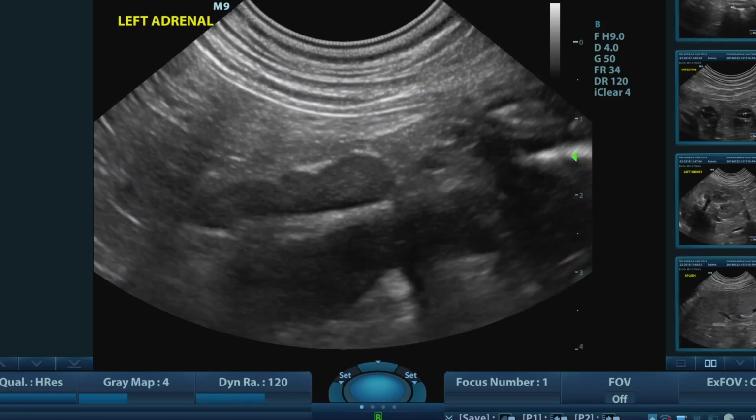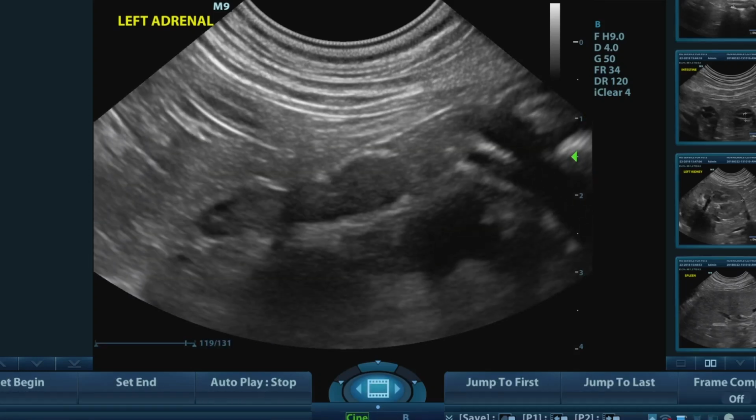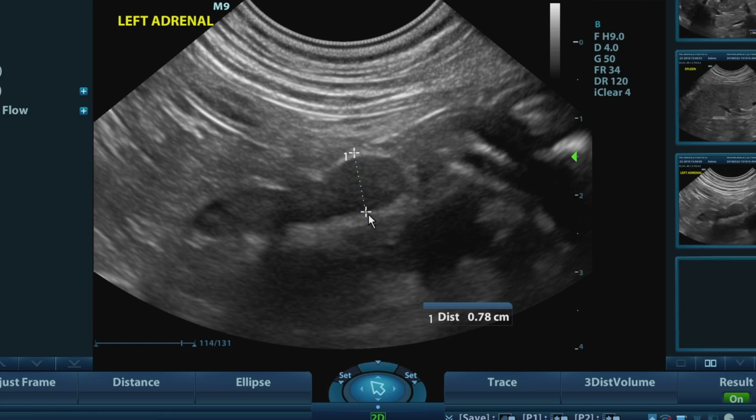We are satisfied if the patient has no symptoms of adrenal disease and normal measurements of the right and left adrenal gland are similar. If the measurements differ considerably, we recommend repeating the measurements of both adrenals, using different methods if necessary.